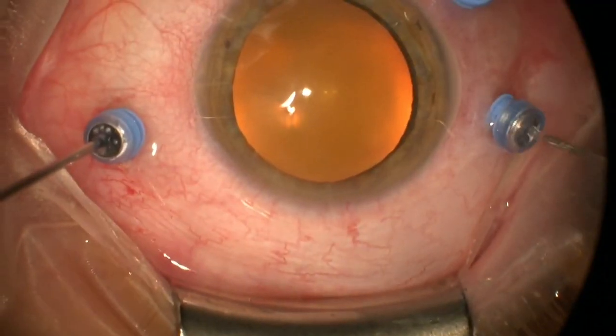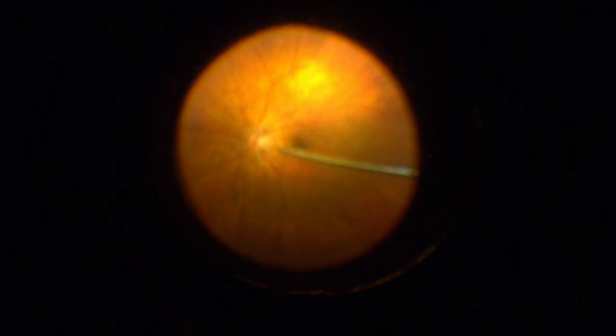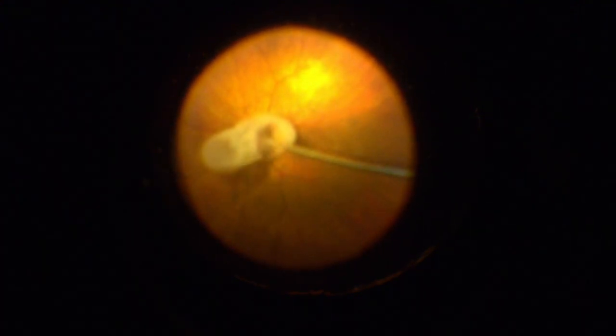Jenny's helping us here. Unless this cannula is long. There we go. So we're just gonna come down here and put in not even a tenth of a cc. A little bit more, just think it'll go poof. There we go. So you can see how it's kind of being held together there, indicating some vitreous likely is in the neighborhood. We're going to take a look here and you'll see how it reacts. You can see how it's kind of tugging. And the Kenalog comes out pretty easily.